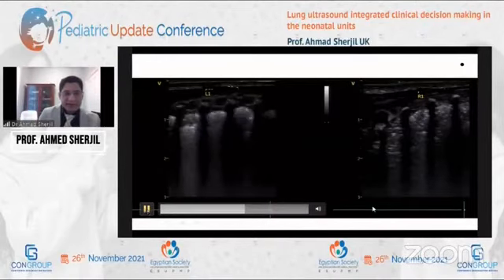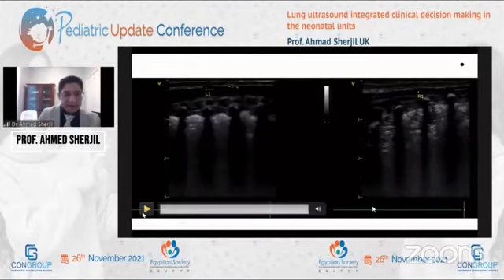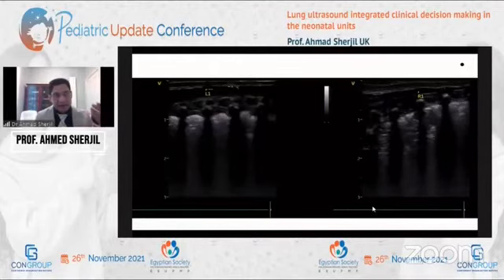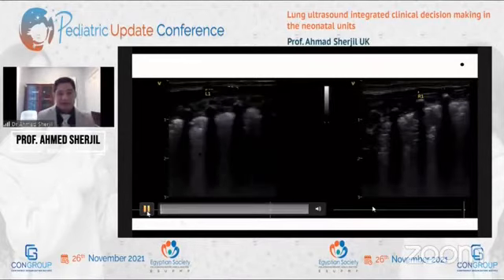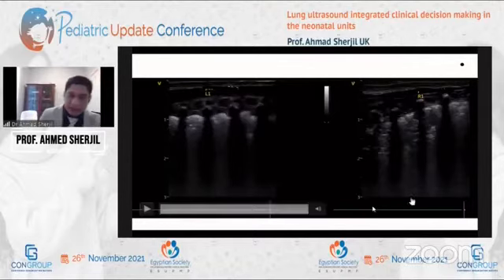In fact, there are lots of bronchograms, lots of subpleural echogenicity, and this appearance of white and black, so echogenicity overlying hypoechoic areas, which is suggestive of consolidation pneumonia rather than a simple collapse. However, looking at all 6 zones, I've shown you just 2.